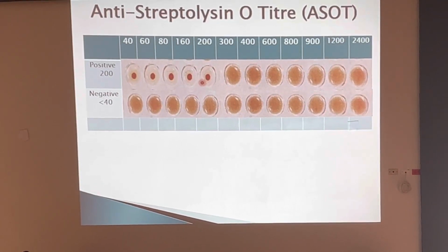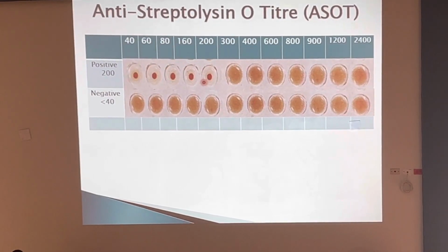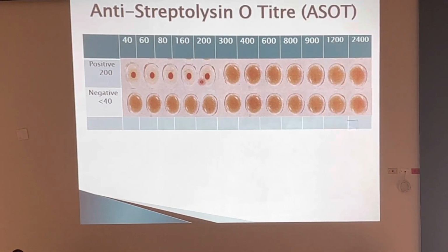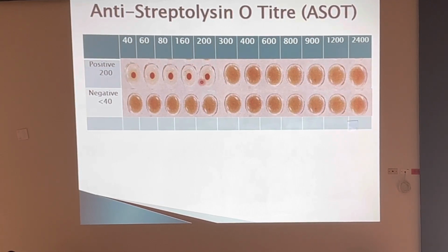So hold on, let me tell you what the challenge is that I think you're having. We have antibodies in this sample here. Imagine that I have a vial here. Now this vial, like I said, has antibodies. If I dilute that sample, I'm diluting the antibodies as well, right? So I want to get an indication of how much antibody is in the patient's sample, how ill the patient is.